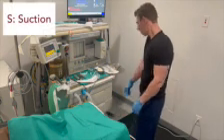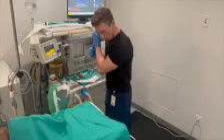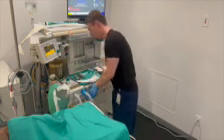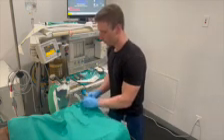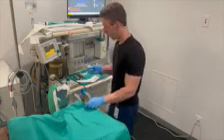The S stands for suction. Ensure that there is sufficient suction through the vacuum and that the yonker and all other connection points are secured firmly. Many anesthesia providers will place the yonker underneath the patient's pillow so that it's within easy reach during direct laryngoscopy. It's also prudent to have an endotracheal suction catheter available for intraoperative use as well.